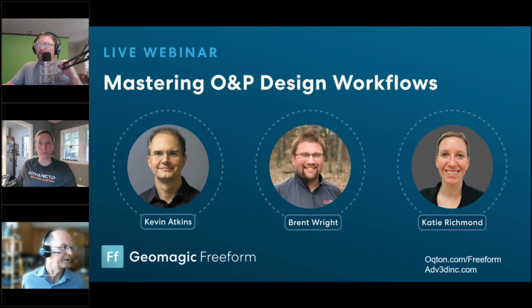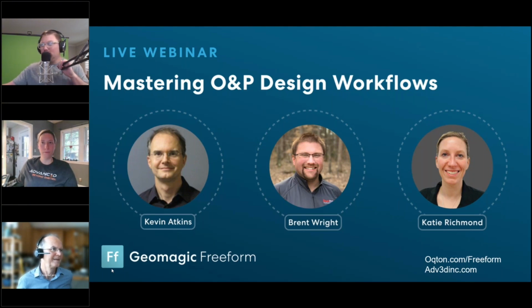The next one is for Brent on Mesh Mixer. It says, Brent, were you also involved in the 100% Mesh Mixer prosthetic workflow design process that can be found on the Mesh Mixer YouTube? I was definitely an early adopter. I was not the first, but I think I helped add to the body of knowledge of the Mesh Mixer workflow.